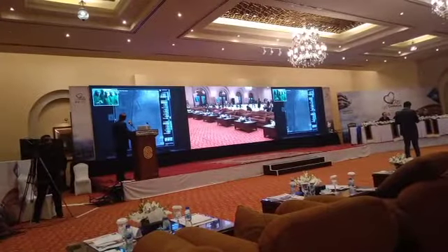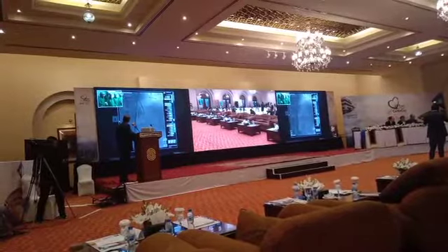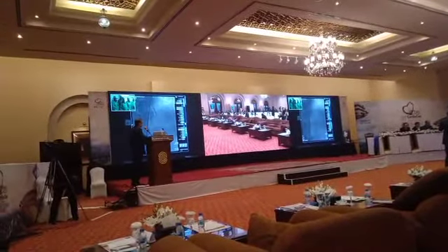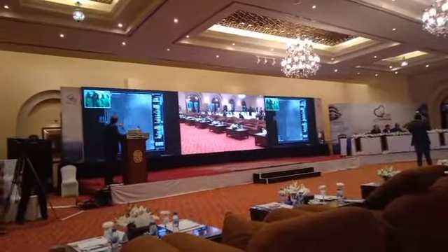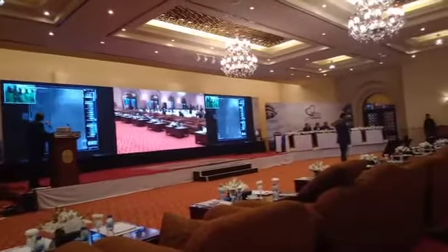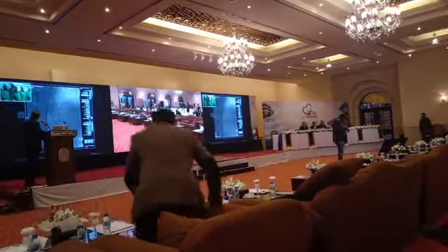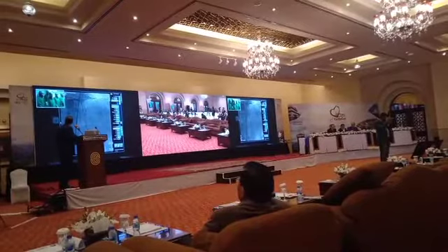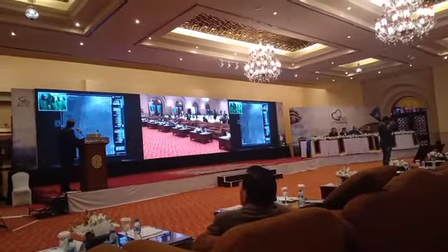And you can see this very proximal segment. You can see dog bone of this 2.5 balloon, which suggests that actually there is probably some calcification in that proximal segment, which has probably restricted the expansion of the stent, although the stent is probably smaller than that proximal segment anyway, the 275. So next picture, please. So this is kind of where we're up to now. So that's what we've done so far.